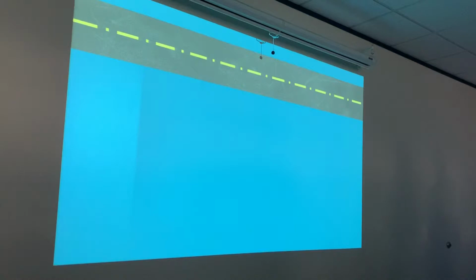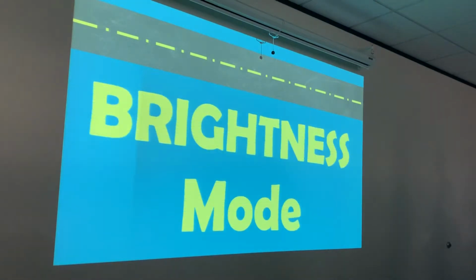Questions for A mode, amplitude mode? What's our x-axis, Mr. Seal? Time or depth, guys. Time or depth. What's our y-axis? Amplitude, guys. Amplitude.